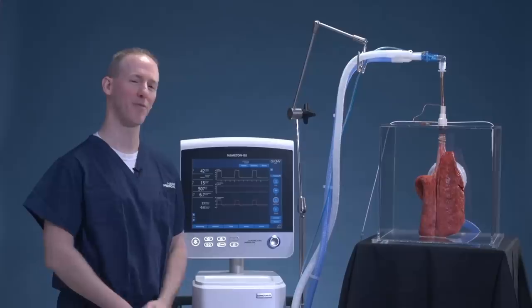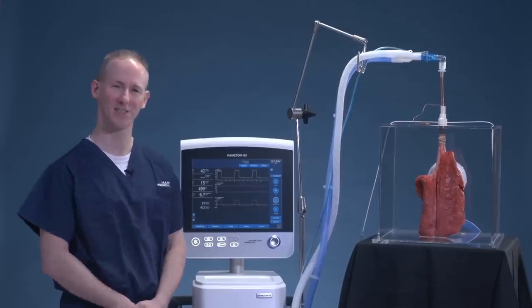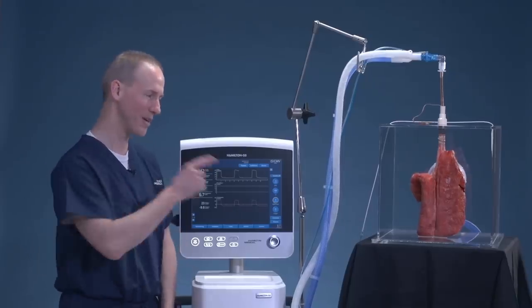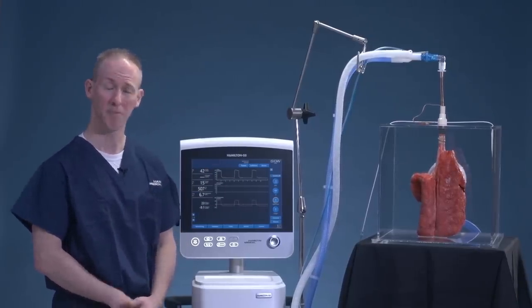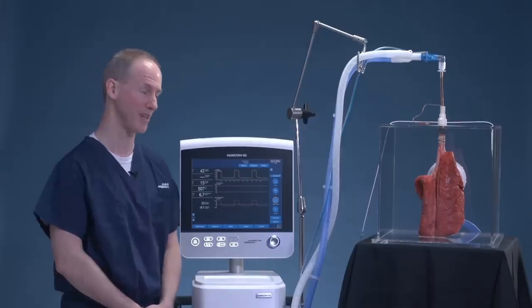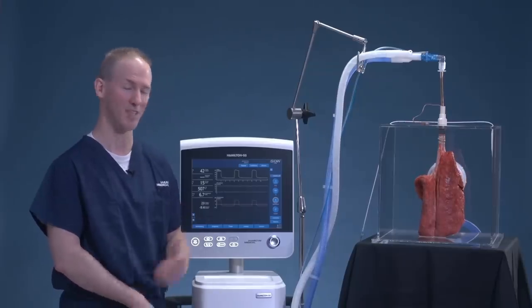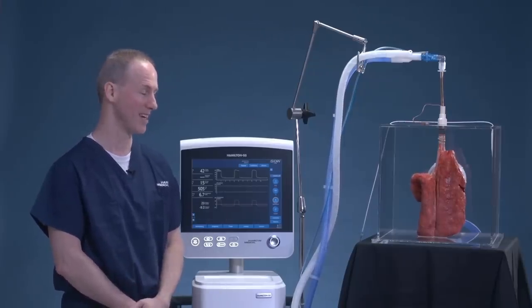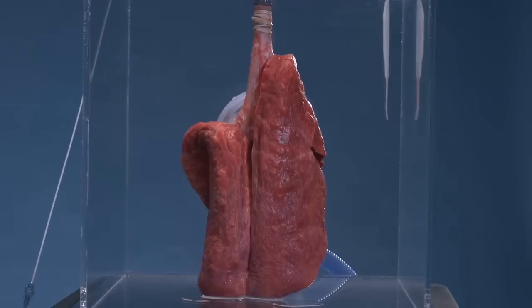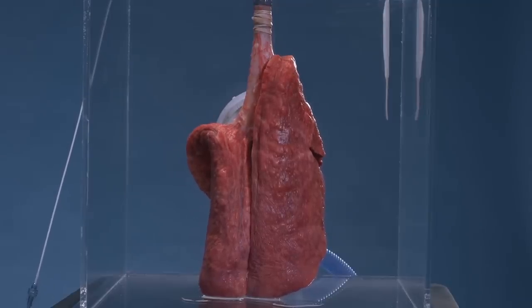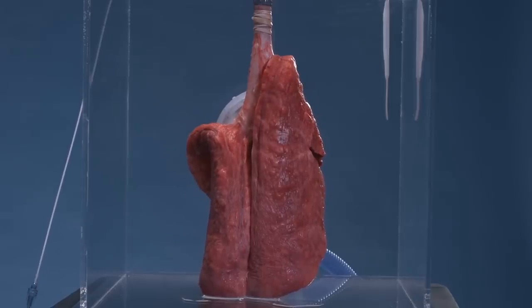To demonstrate what happens when the pressure outside the lungs exceeds the pressure we've applied with PEEP, we've increased the pressure to this box to 16 centimeters of water pressure. Because we have an esophageal catheter in place, we can tell you exactly what that pressure is and reconfirm the settings dialed in. Notice just how many of those alveoli are collapsing from breath to breath — we know that cyclic alveolar collapse exacerbates lung injury.